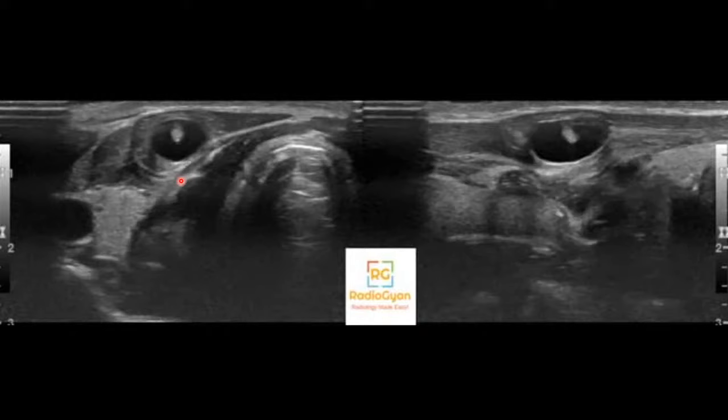In fact, a very interesting investigation in this case is what is known as whole body MRI. So what we can do is scan multiple sections of the body and stitch them together, say a fluid sensitive sequence, and you will see something known as a starry sky appearance. So cysts which are throughout the body, intramuscular, subcutaneous, they light up. And if you just Google, in fact, we have written up a case report ourselves. So disseminated cysticercosis can give rise to this starry sky appearance.